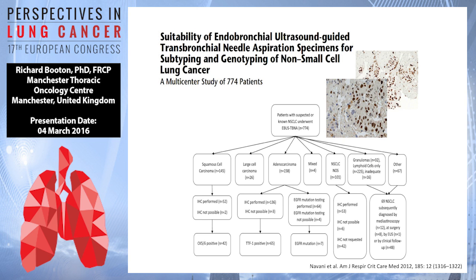It would be difficult to speak to an audience without suggesting that the samples we provide, whilst tiny, can accommodate the molecular oncology agenda. I think you have to be a little bit more aggressive and provide a little bit more tissue than perhaps we did 10 years ago. But if you know what you're doing the procedure for, you can certainly make sure that you have adequate material for IHC, for molecular path.